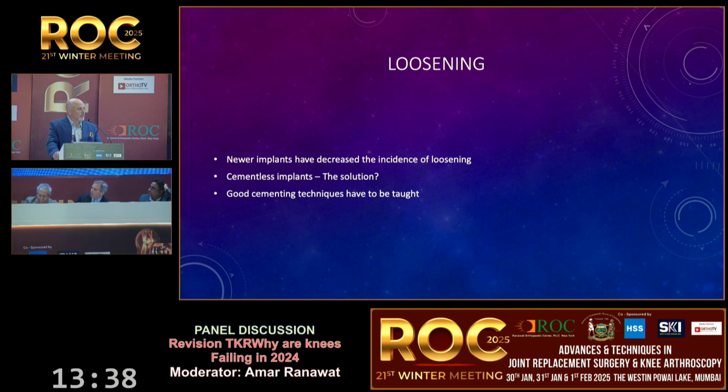So I use cementless knees in probably 2/3 of my knees right now. And I'll be the person to sit here and say, the best thing we can say about cementless total knees is we hope they're as good as cemented total knees. We do them because they're faster and easier, right? Same reason as we do them for hips. And that's why they took off, because they're faster and easier. But at 20 years, we haven't seen an outcome difference in terms of loosening between cemented and cementless.